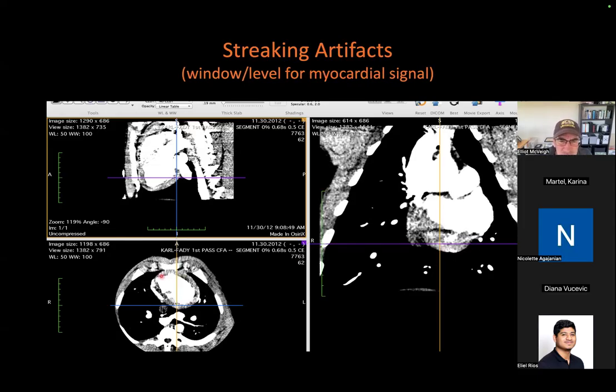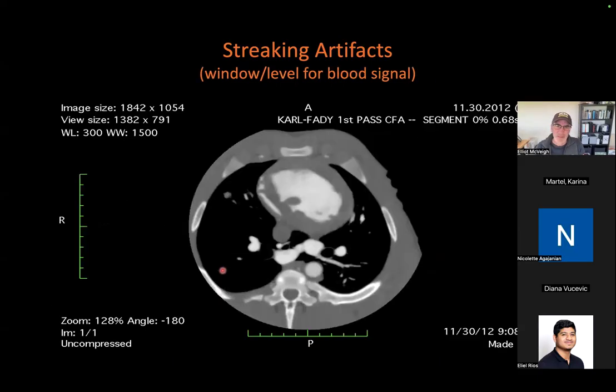signal? When you look at the background here of myocardium versus the blood pool, you can see that the signal is not very uniform in this case, right? So if we're trying to measure that signal level and the change in that signal level over time to measure blood pool flow, we might be susceptible to artifacts given the high variation there.